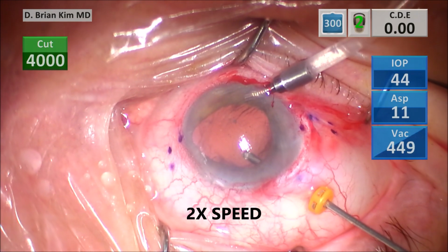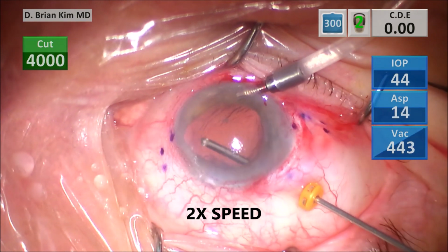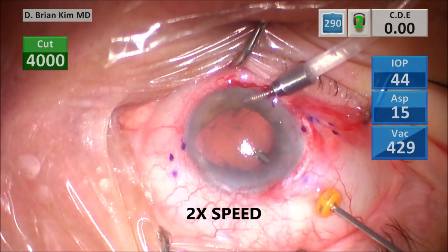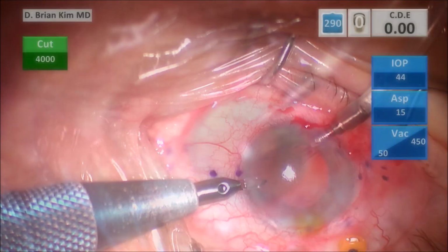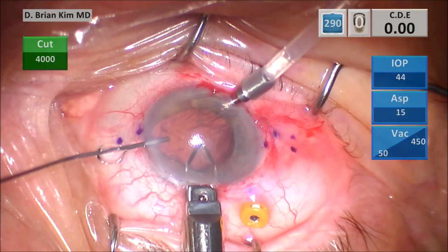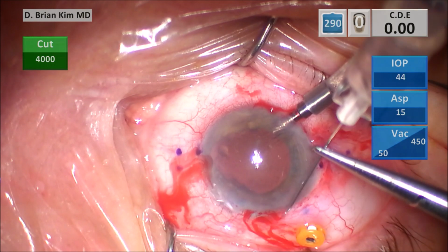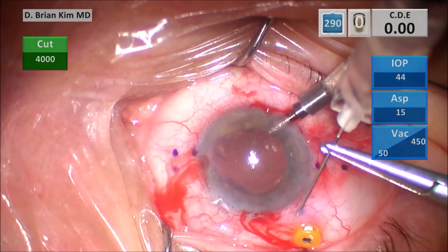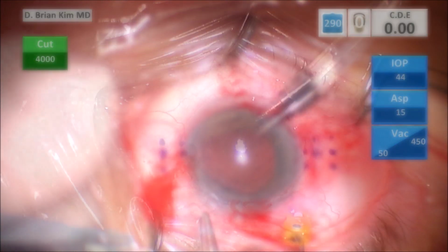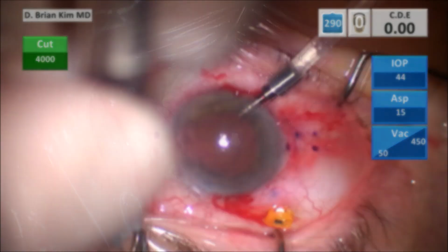And as you can tell, I did rotate my chair, so I'm sitting more supratemporally versus when I did the ACIOL explantation. So I'm placing my incision, and then I'm going to go ahead and make my 3 millimeter incision that's going to be contra-incisional to the incision for the externalization of the leading haptic. I am bending my needles, first on the right needle and then the left needle, and I make sure that the needle bend is going to be facing the approach of the haptic.